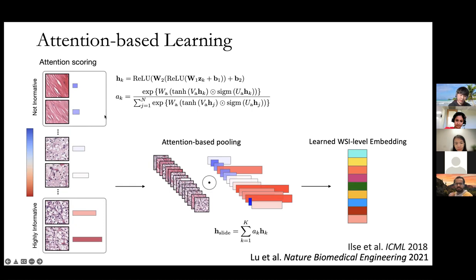It's an interesting question, because I think there have been some recent works that explore this. This is a typical soft attention setup, where you look at every single region in the slide, compute its relevance, and then do a convex combination to do this pooling operation. This is no problem. It's fully differentiable. You can train it using gradient descent.